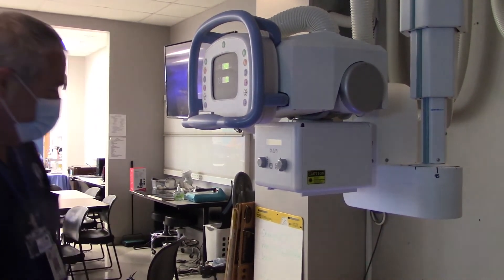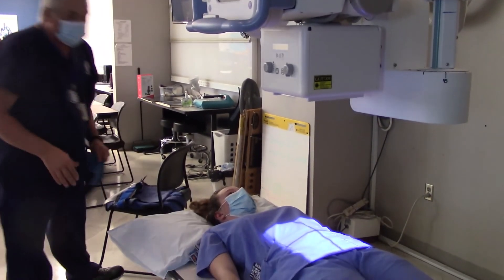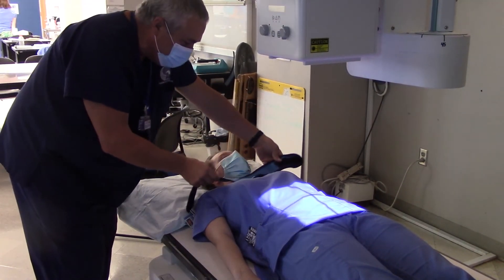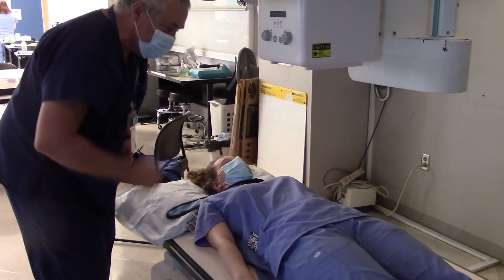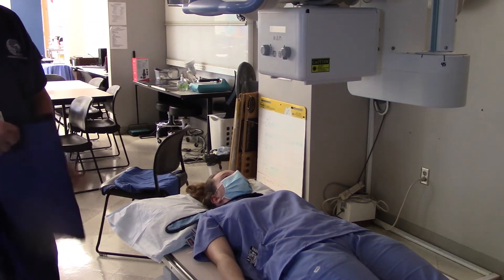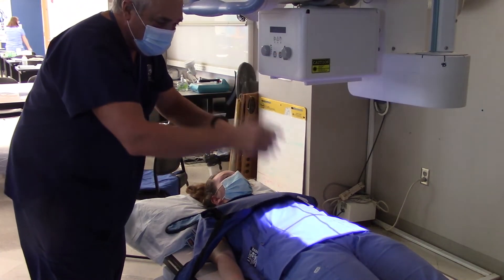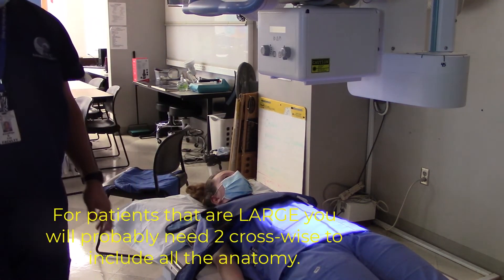Now I need to give my patient some shielding. I can't shield the abdominal area or the gonads, but I can shield the thyroid. Remember, a female's thyroid is about four times as sensitive as a male's. For this young lady, because she is very young, I can also shield her breasts — I just want to make sure that my lead shield is not anywhere in the light field.